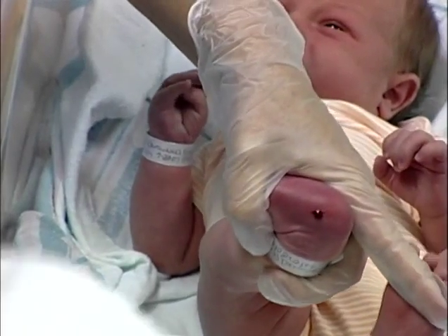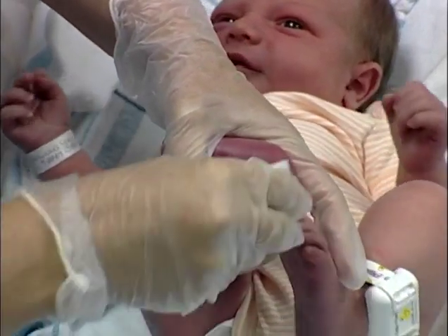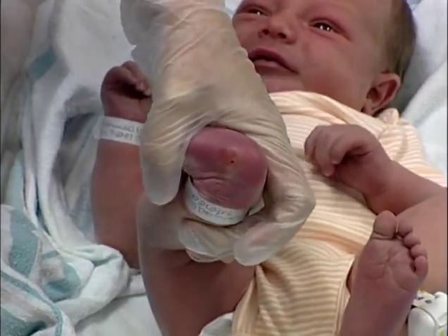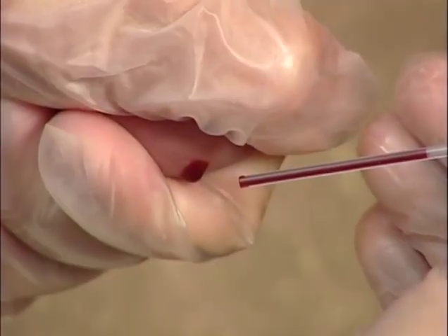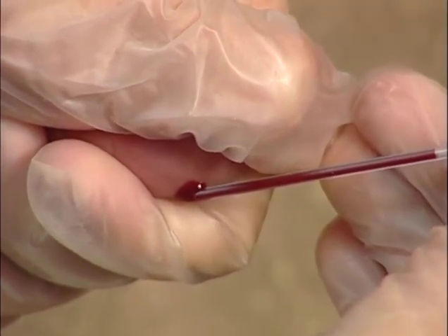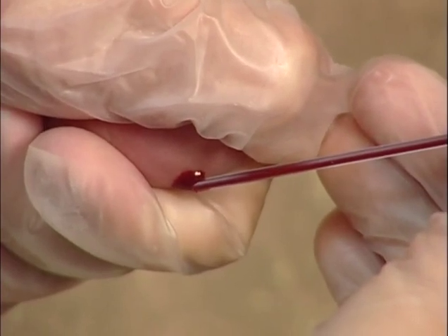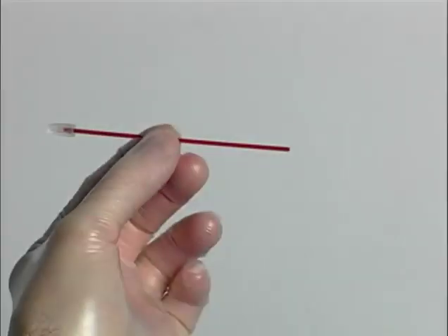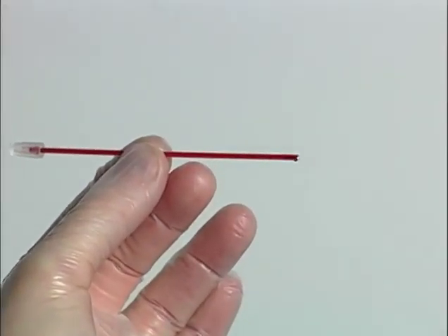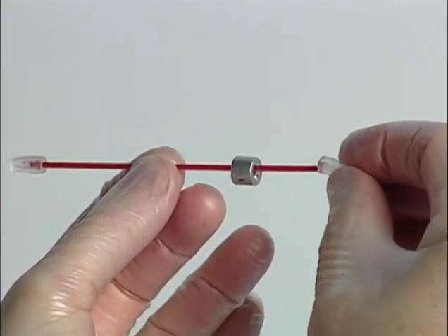Wipe away the first drop of blood using a clean gauze pad, since this drop contains tissue fluid from the trauma of the puncture and may dilute or contaminate the specimen. Allow the blood to flow horizontally into a heparinized capillary tube so that no air bubbles enter the device. Do not milk the site to facilitate blood flow. When an adequate sample has been obtained, apply pressure to the puncture site and seal one end of the tube with a cap or other sealant.